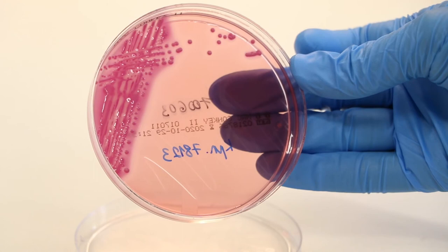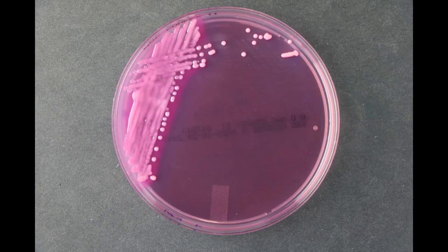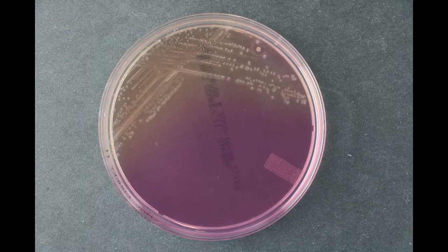On the selective McConkey medium, only gram-negative bacteria will grow, and the color of the colonies allows a categorization in lactose-fermenting or non-fermenting bacteria.